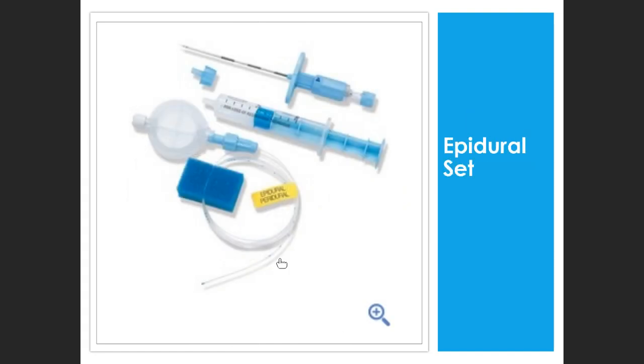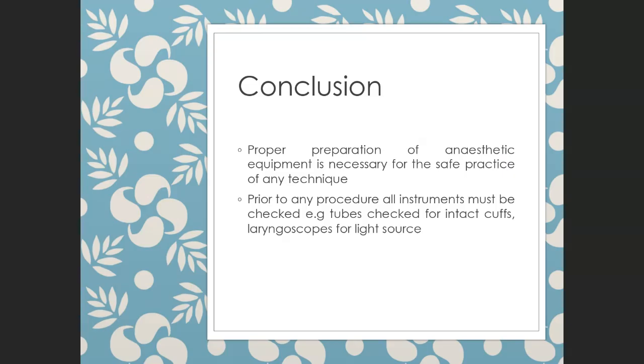And this is the whole kit. You just need to know that's the filter, nothing goes through it. This is the loss of resistance needle, and so on. As I say, Friday, we'll talk about it.